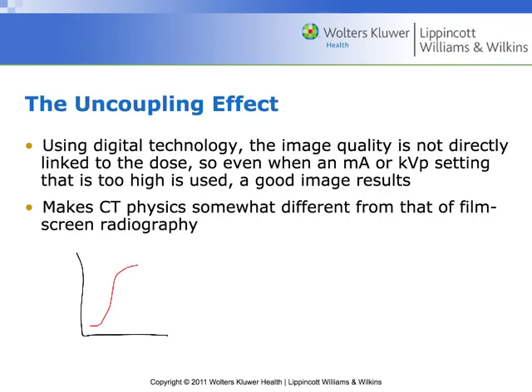curve. So it's kind of an S curve like that, and we knew that below this level we wouldn't get good pictures. Like below here we wouldn't get good pictures, and above here we've burned it out. So the pictures we're taking were in this range of energies, okay? And the contrast of the images were related to that slope there on that characteristic curve. What we see with digital radiography and with CT is something more like this. We just see a straight line portion. There's a point below which we're not going to get good pictures, but there's no upper bound to it, okay?